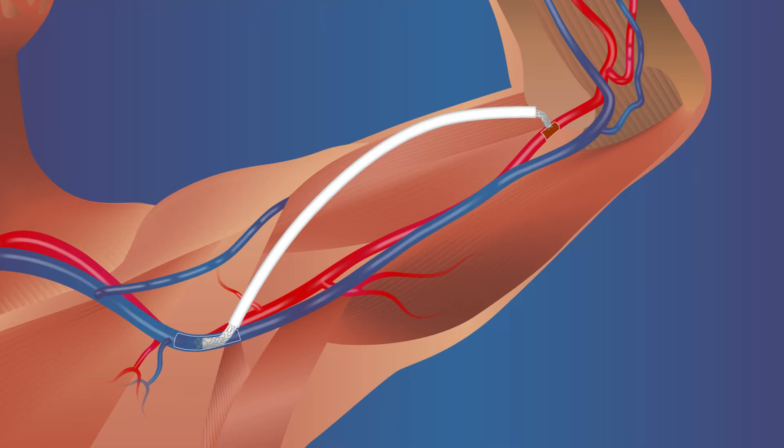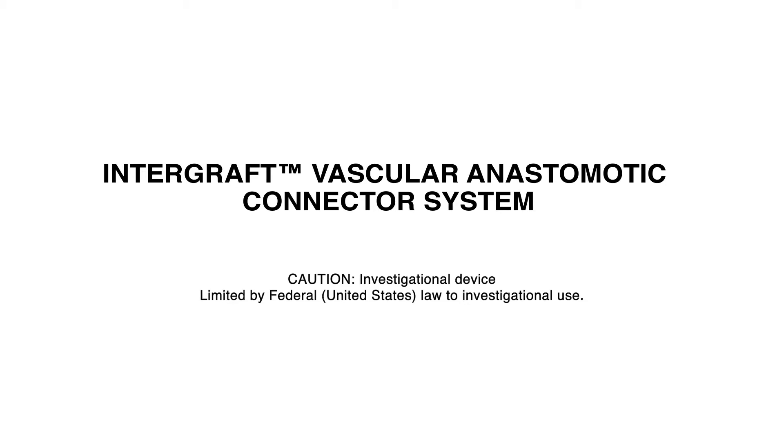The following video is a conceptual illustration of the interventional procedure for connecting an arteriovenous graft using the intergraft vascular anastomotic connector system. In clinical use, the procedure is performed using fluoroscopic guidance for precise positioning of the venous and arterial intergraft connectors within a vein and artery. The video illustrates the preparation of an upper arm arteriovenous vascular access graft using the axillary vein and brachial artery.